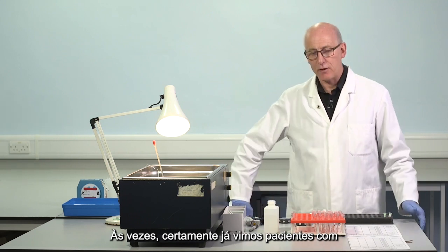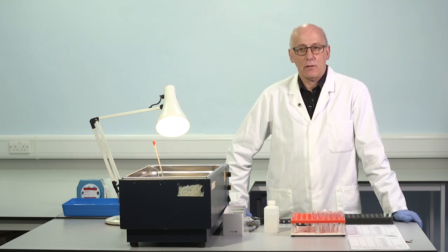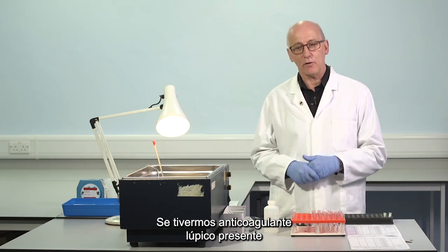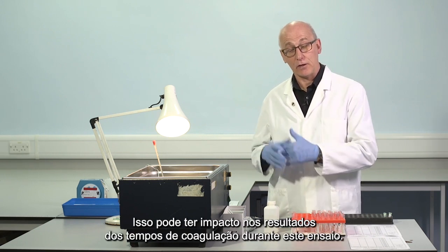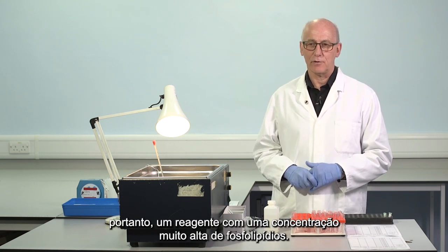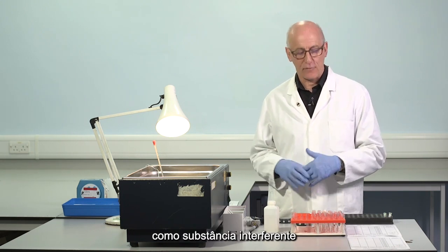Sometimes we've seen patients with both acquired haemophilia, anti-factor VIII antibodies, and in addition antiphospholipid, lupus anticoagulant. So they can occur together in the same patient. If lupus anticoagulant is present, that could have an impact on the clotting times in this assay. Therefore there is some advantage to using an insensitive reagent, a reagent with a very high phospholipid concentration. This will minimize the impact of lupus as an interfering substance.